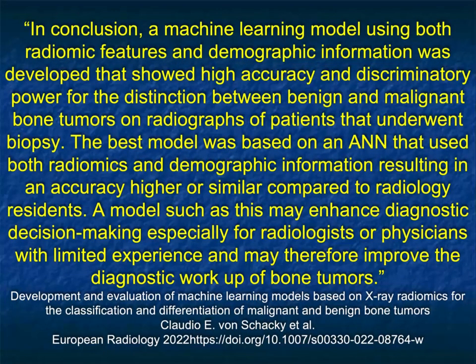Here's another article, again, the same article, talking about machine learning using both radiomics features and demographic information, which showed high accuracy and discriminatory power for distinction between benign and malignant bone tumors on radiographs of patients that underwent biopsy. Concluding, the authors felt that a model such as this may enhance diagnostic decision-making, especially for radiologists and physicians with limited experience, and therefore may improve the diagnostic workup of bone tumors.